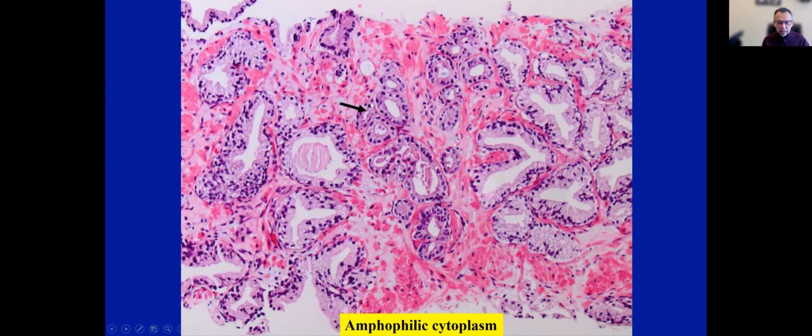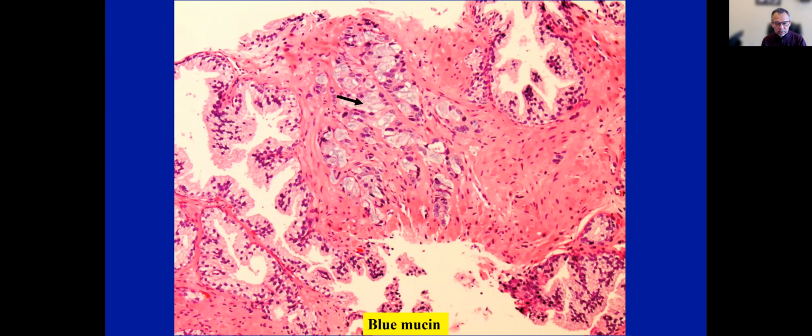So here notice that these glands, even though they are relatively limited, clearly appear abnormal. There is an abnormal infiltrative type architecture. And you can pick these glands more confidently by noticeable cytoplasmic differences in reference to these adjacent benign glands. So pay attention to those subtle cytoplasmic differences to pick this type of abnormal process.